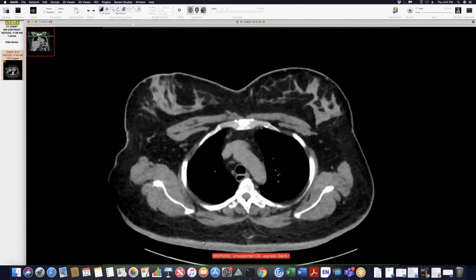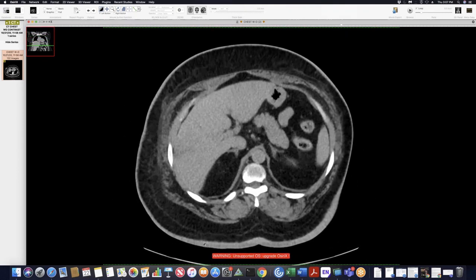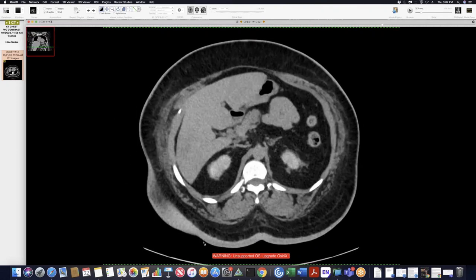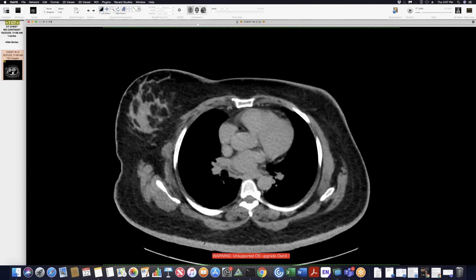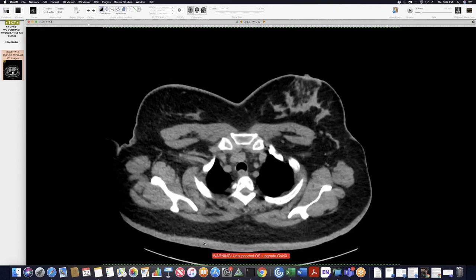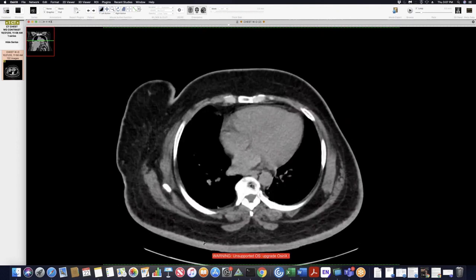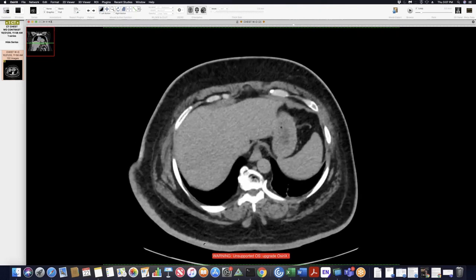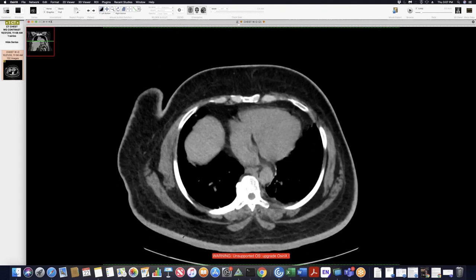And it's not new, it was there on a scan from a few years ago. This isn't the best scan to show, but I didn't include the abdomen, but it definitely gets worse as you go below the diaphragm, the skin thickening. So we weren't completely sure, but I know chronic kidney disease and dialysis, as well as diabetes, all have multiple different dermatologic manifestations. So it might be just a combination of the chronic kidney disease and the diabetes causing this kind of skin abnormality. But we see diabetics and patients with renal failure all the time, but this was just more skin thickening than we were used to seeing.